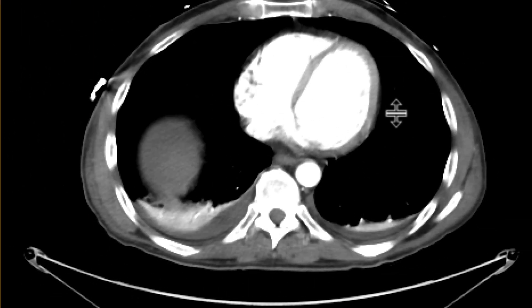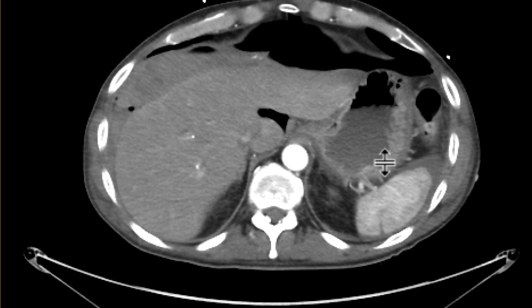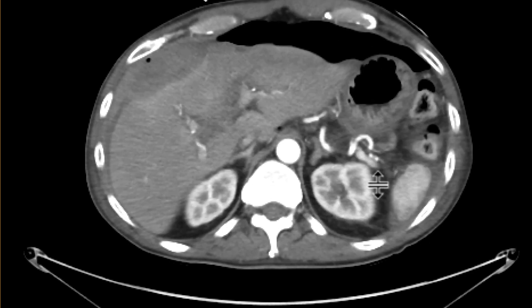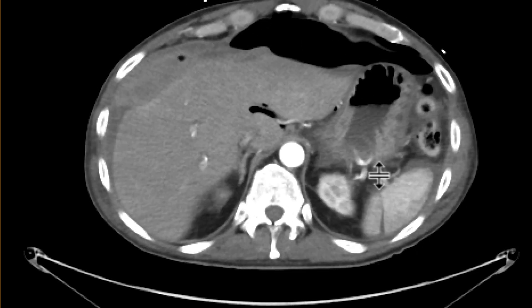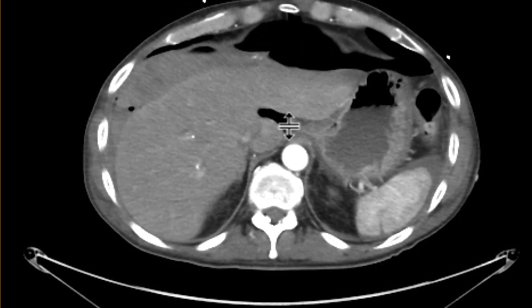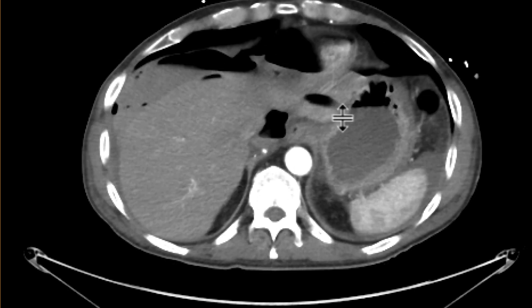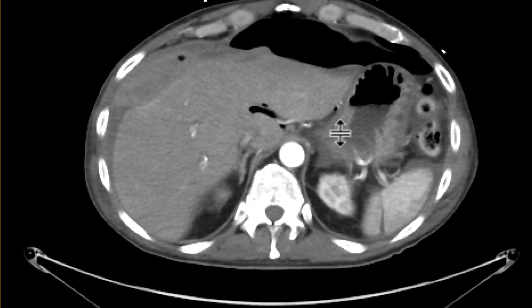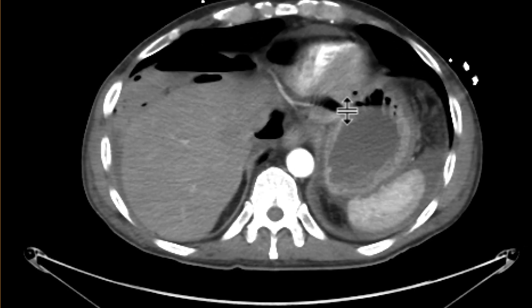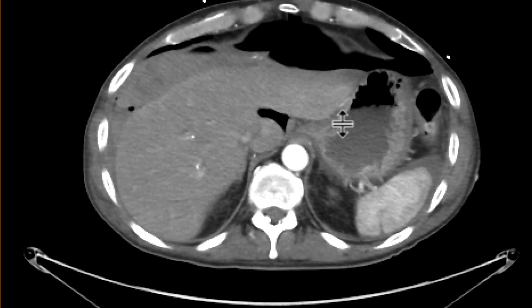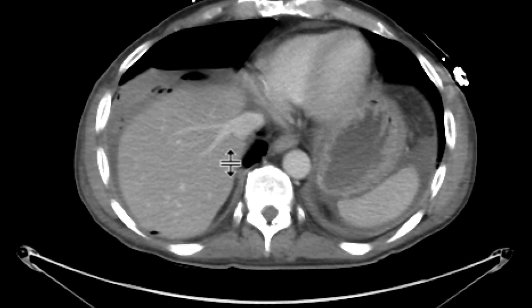As we look at the arterial phase, we can see amidst all of this a very subtle but certainly a few tiny foci of contrast that are accumulating there. Those findings are compatible with active extravasation, as we can see on the arterial phase.